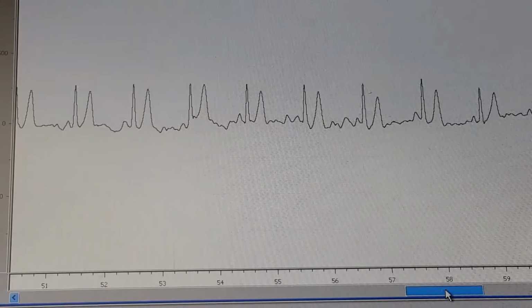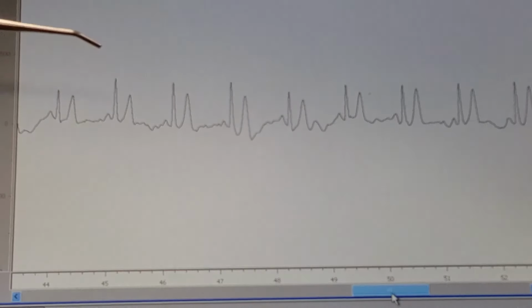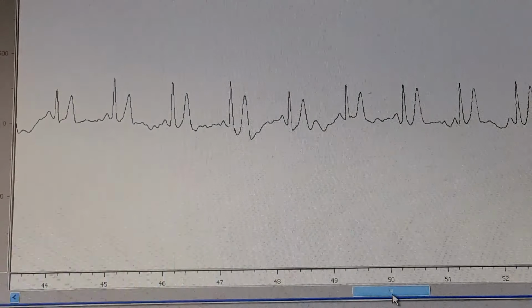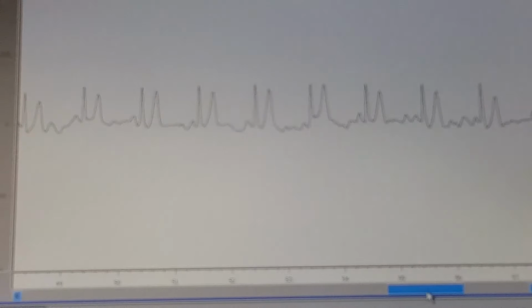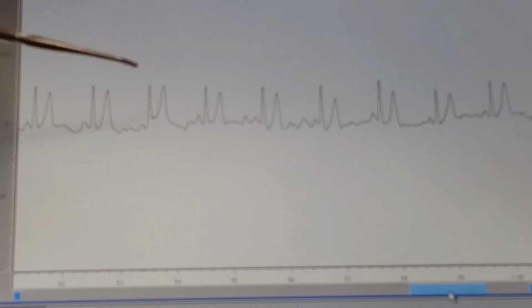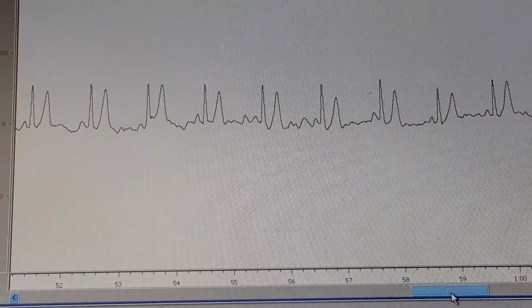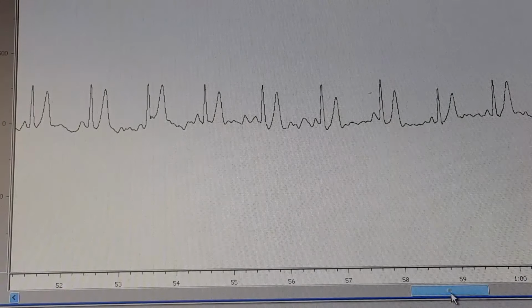No, I didn't plan that. Let's double check and make sure I counted correctly, because I had a little stutter in there. Starting at 45 seconds, 1, 2, 3, 4, 5, 6, 7, 8, 9 to this one right past 53. Ten, 11, 12, 13, 14, 15. So 15 cycles, or QRSs, in 15 seconds.